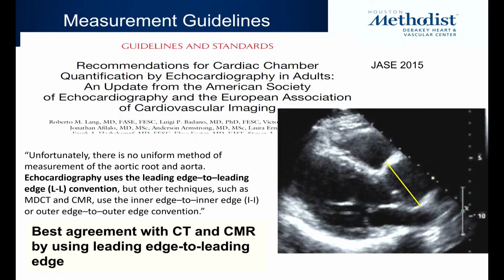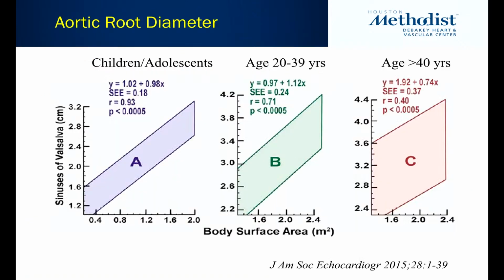Now, you heard very well the difference between echocardiography and CT-CMR for sizing. By ultrasound, the recommendations are still to go leading edge to leading edge. So it would be from about here down to the edge here. And when you do that and compare to CT measurements, there is frequently, most of the time, very good agreement if it's done properly.